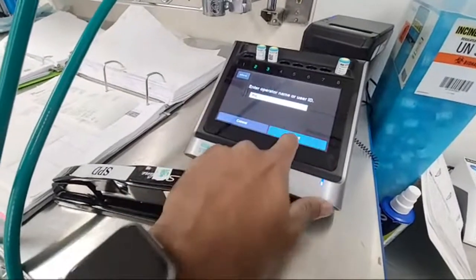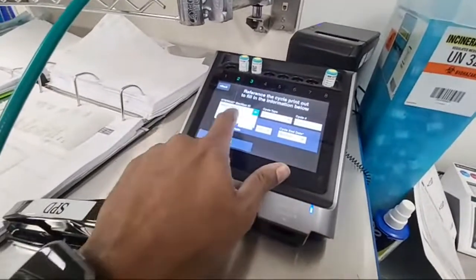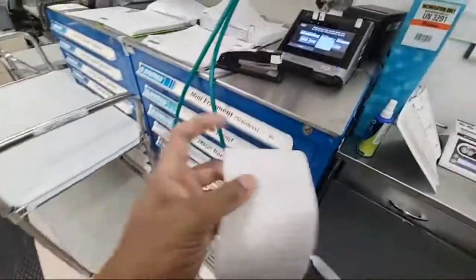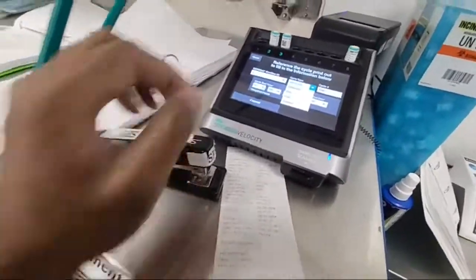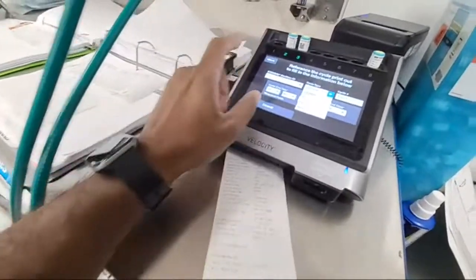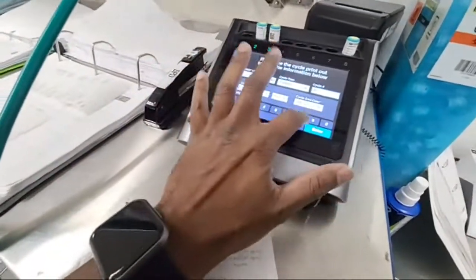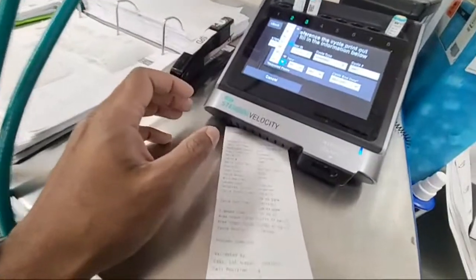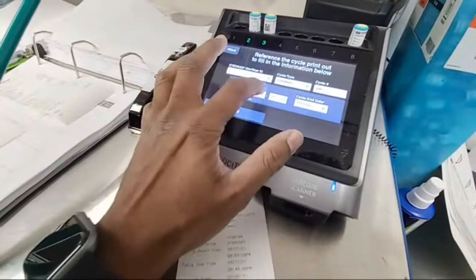That's my name. Yes. Yes, it's yellow. It changed color. They're verifying that too. And here's where I need that information. Oh, I'm holding it. There it is. So this is similar to what I guess many places do, although some of it might be more automated than this. It ran as a standard cycle. Cycle is 2081. None of this is a HIPAA violation. Don't worry. I will end this as soon as I feel that it might be.